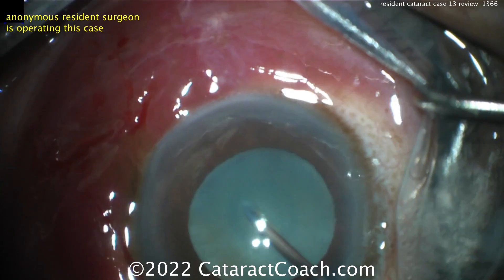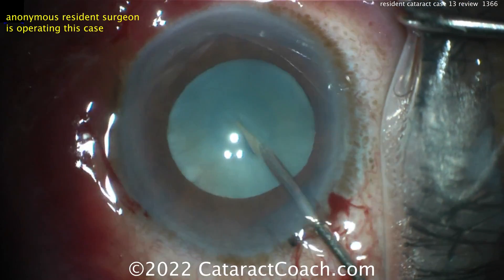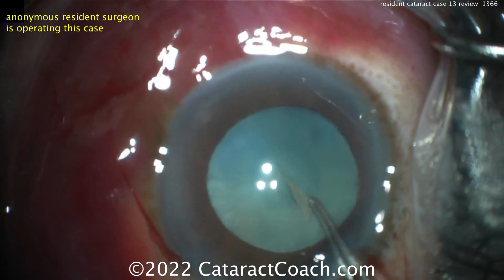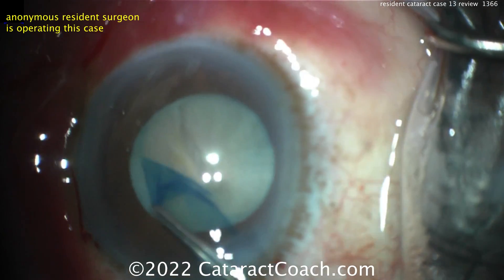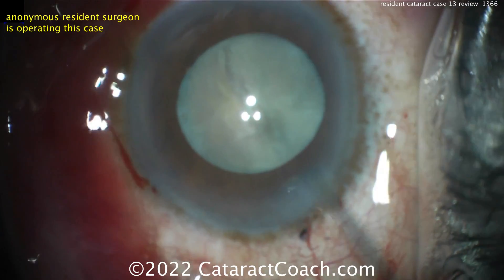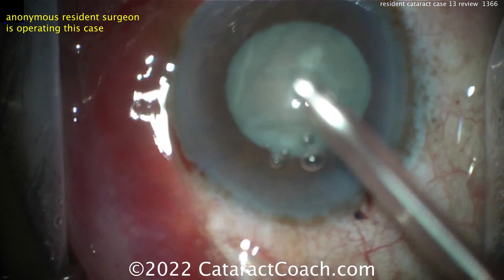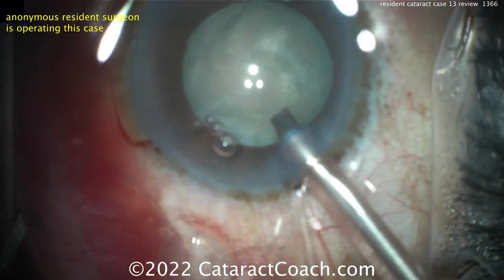It looks like needle decompression — make sure it's not an intumescent case. Tough case for number 13. Draping looks pretty good, eye staying in primary, and there's no lens milk or liquefied lens cortex coming out of the bag — that's a good sign. Here comes a big rhexis. You definitely need the rhexis; it's just about as big as that pupil. That's awfully good for case 13. That rhexis looks pretty good with only a few re-grabs.